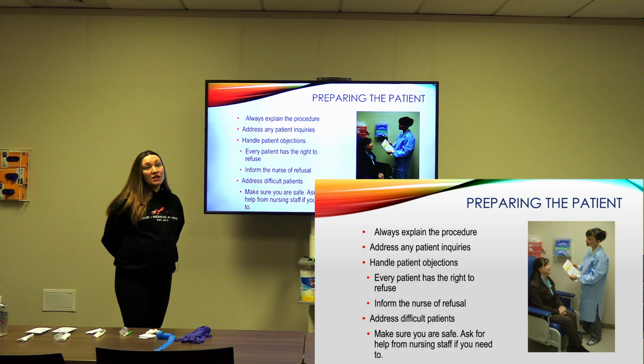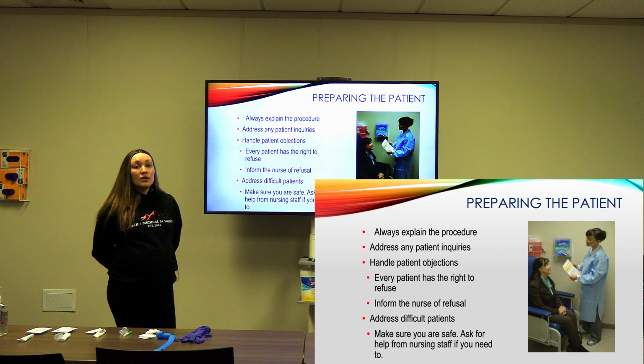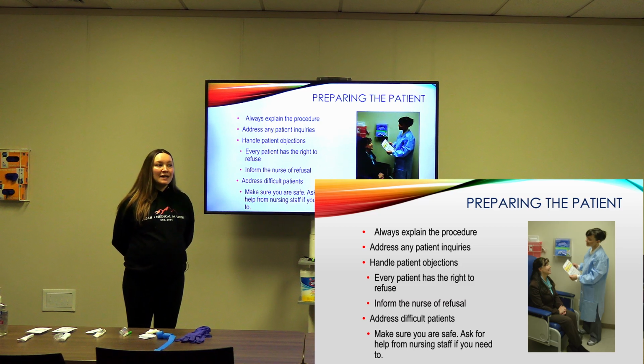Address difficult patients. If a patient is being difficult, you can say, okay, I'm going to let the nurse know that we're not going to take the blood today. Generally, that will get patients to say, okay, fine, just do it. But if they're adamant that they don't want their blood drawn, just let the nurse know, and the nurse can let you know when they want you to come back.